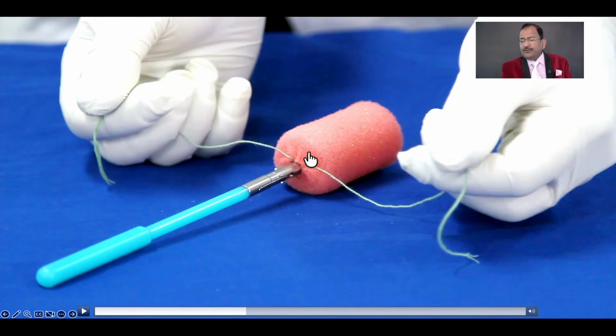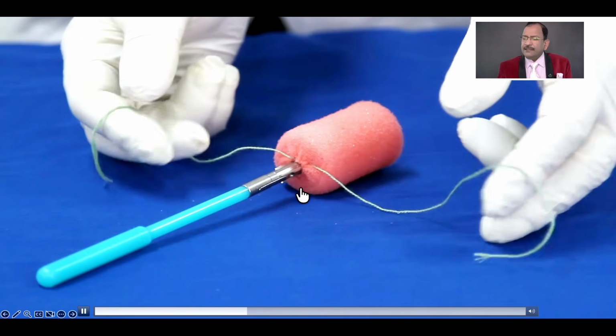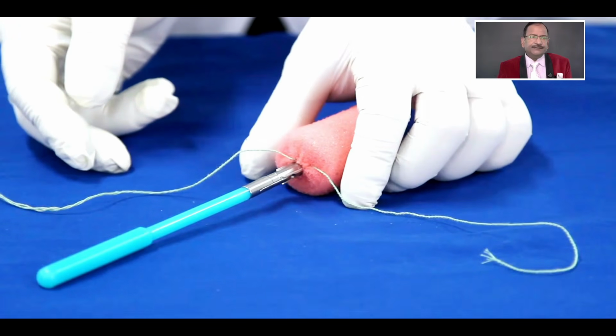Remember, if your purse-string is bad, you will not get a complete donut, just like a PPH stapler. But in PPH, what are we taking? Only mucosa, submucosa. Here you have to take the purse-string full thickness. And after that, it is ready.